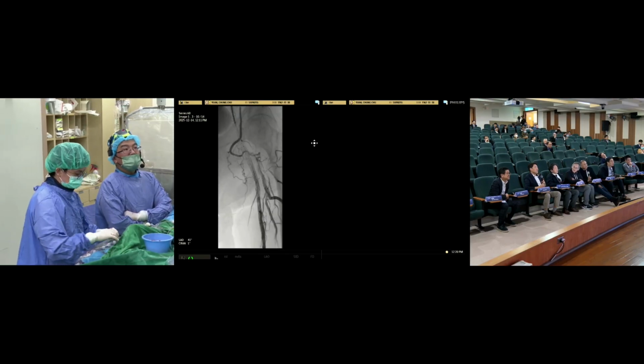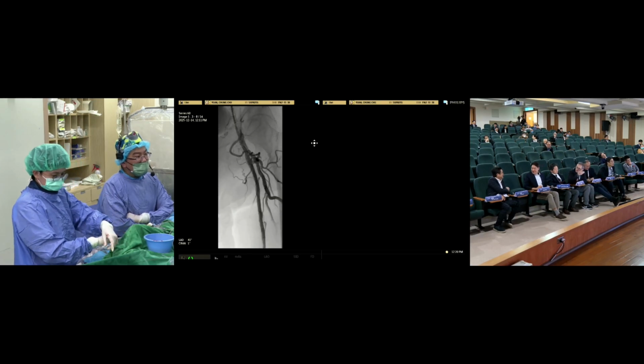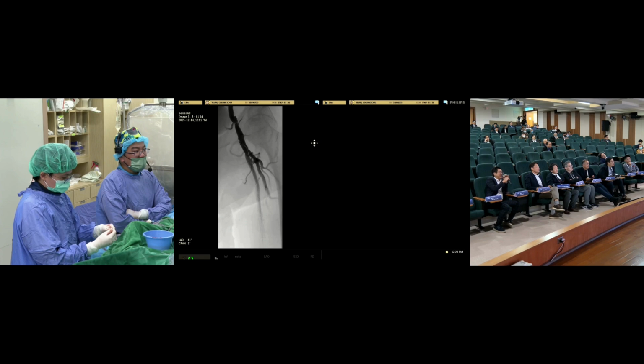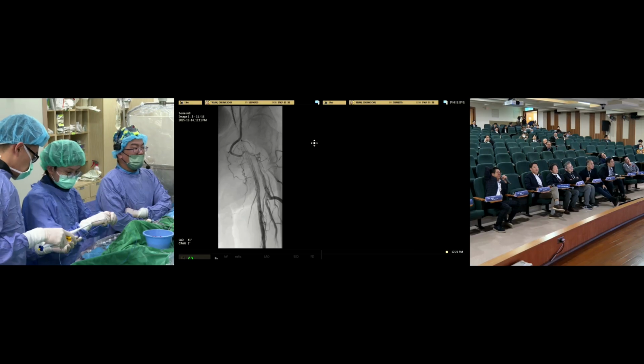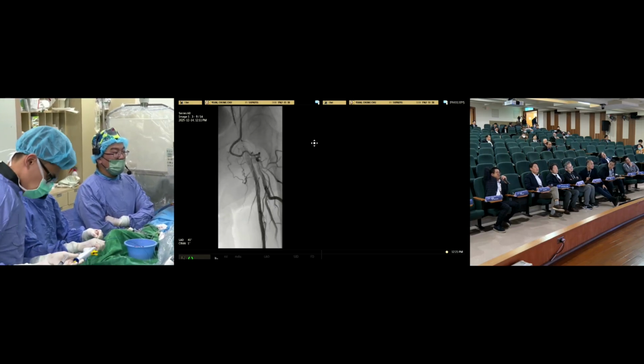It's a difficult case, I think, because we only have 7 millimeter stents. So I think if we put the 7, it might be blown. I think an additional stent is needed, because it's very near the orifice. The SFA is most important. Keep the patency.